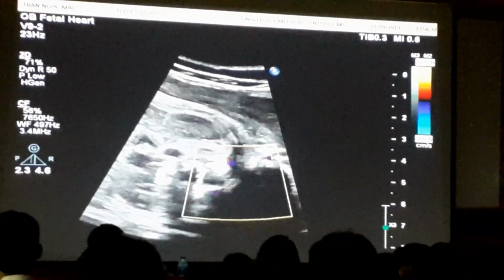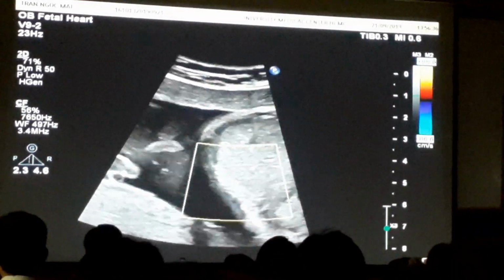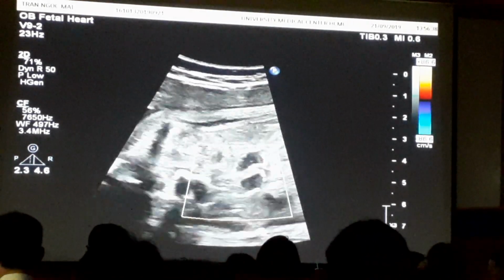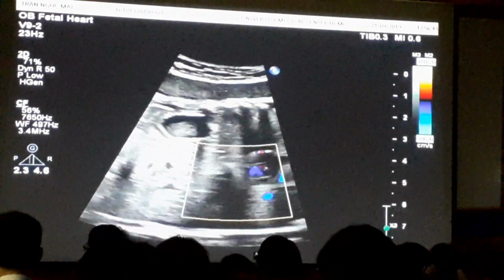Mình có 3 bệnh nhân. Để các bạn đừng có hỏi đi.